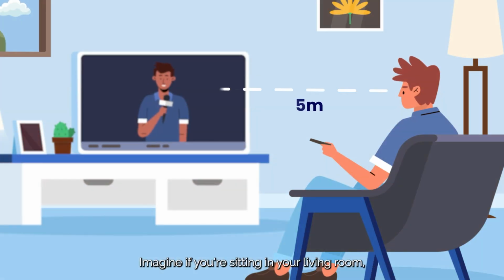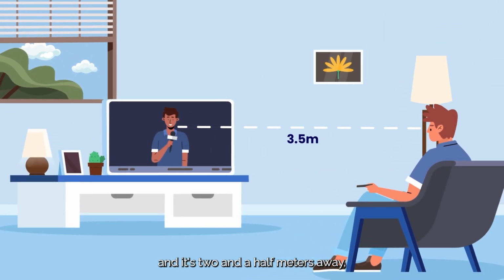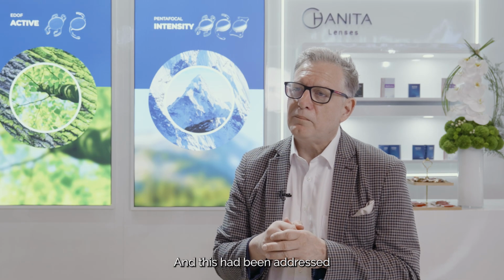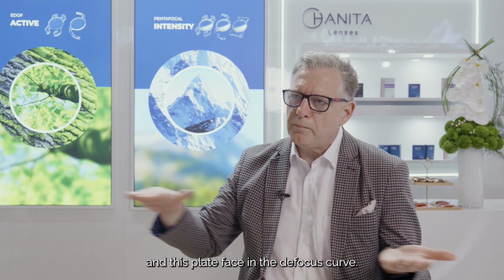Imagine if you're sitting in your living room, you want to see the TV, and it's 2.5 meters away, not 3.5 meters. And then you're in this little zone where you have some unsharp images. We have a lot of complaints in older lenses from patients. And this had been addressed by having this continuous light distribution and this plateau phase in the defocus curve.